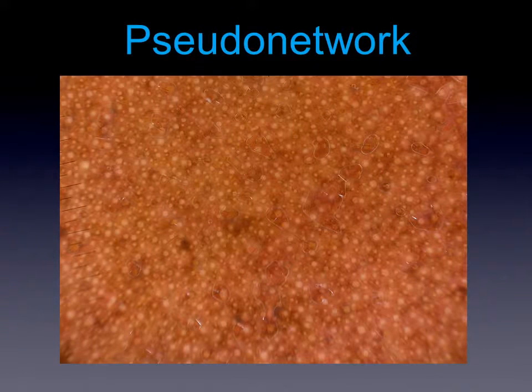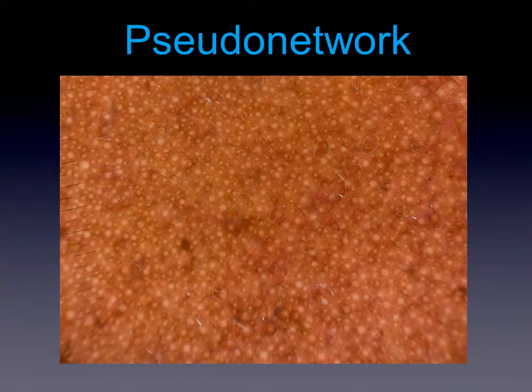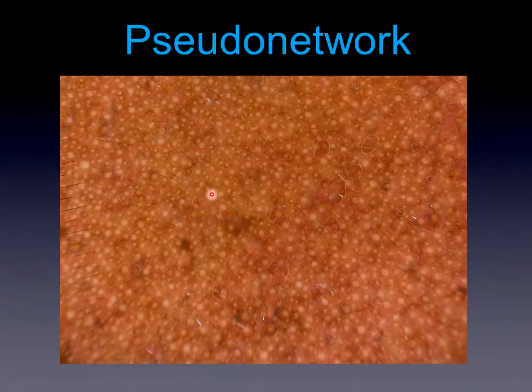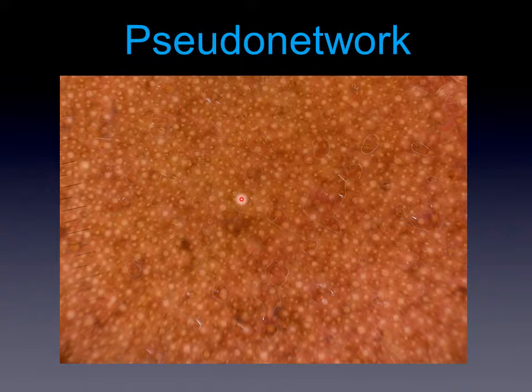Here we see a dark skin and you see the pseudonetwork. We have these holes corresponding to the hair follicles, as you can see here, and also to the ostia of the different glands.